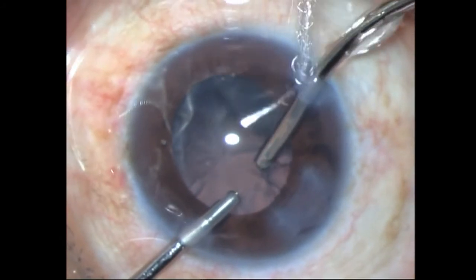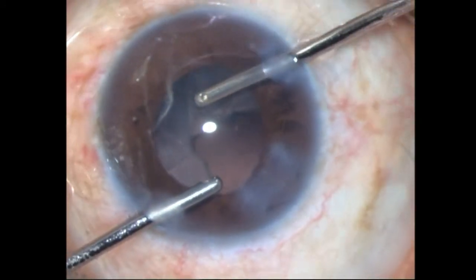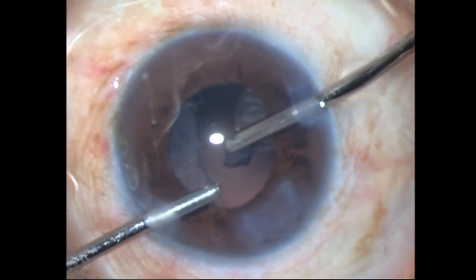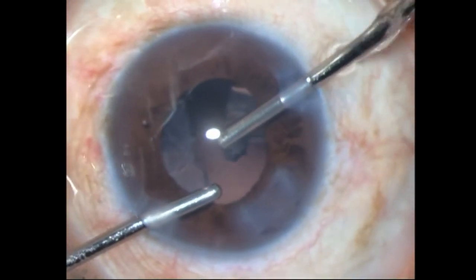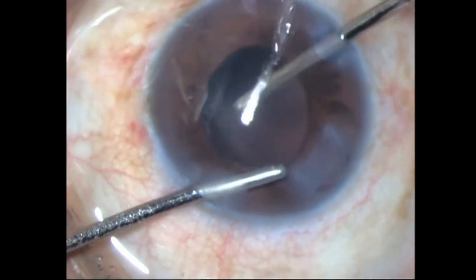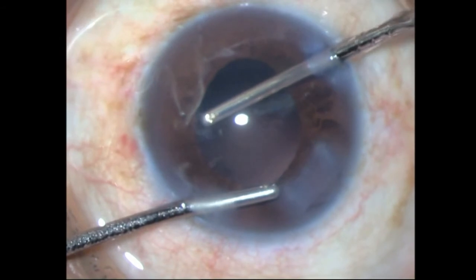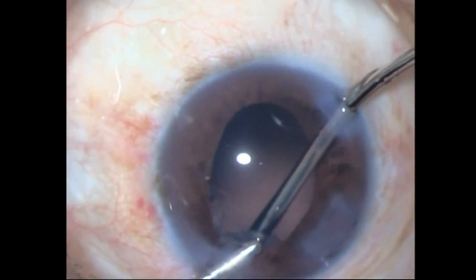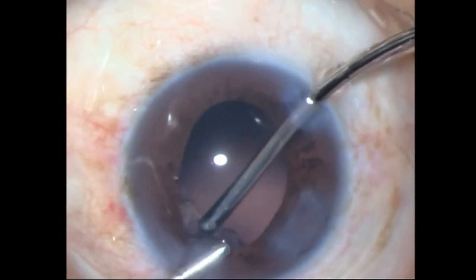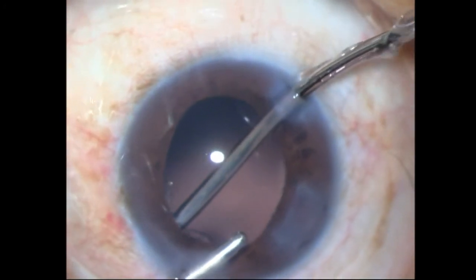I'm removing the cortex segment by segment — sometimes tangentially teasing it along the CTR, sometimes going under the lower part of the cortex and then aspirating. Definitely where it is extremely difficult and not dangerous, I just leave the cortex — I'm not going to risk damaging more zonules. Most of the cortex I'm aspirating within the phaco itself. It's a pretty laborious process.